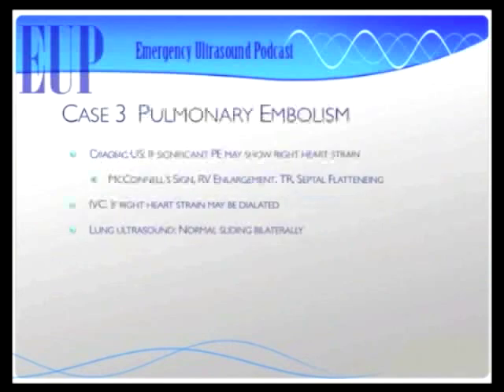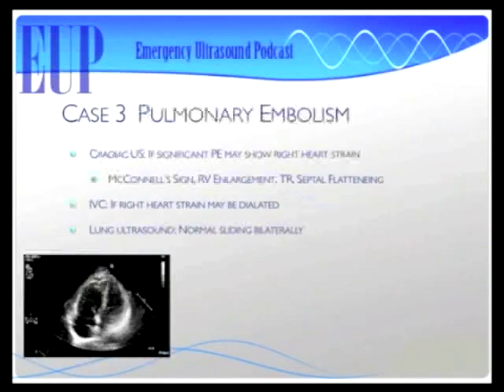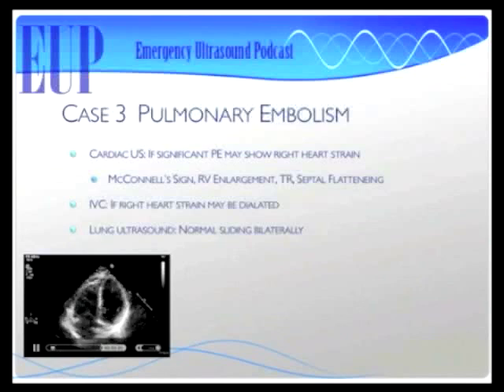So this is an example of a pulmonary embolism. That makes much more sense. Genius, yeah. So this patient had a pulmonary embolism. You can tell they had a McConnell sign. That's the winking that we were talking about on that cardiac exam. So there's the winking in your right ventricle. Big right ventricle, big and dilated. Small left ventricle. You can even see in that apical 4-chamber view that the septum is pushing into the left ventricle because the pressures are so high on the right.